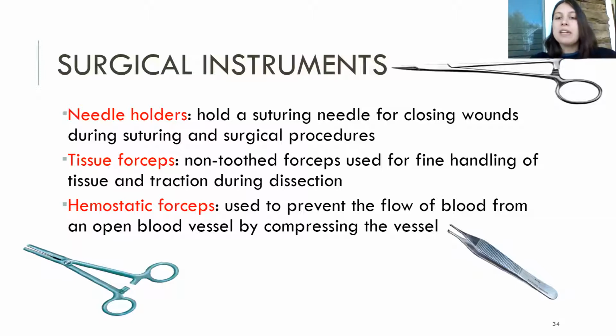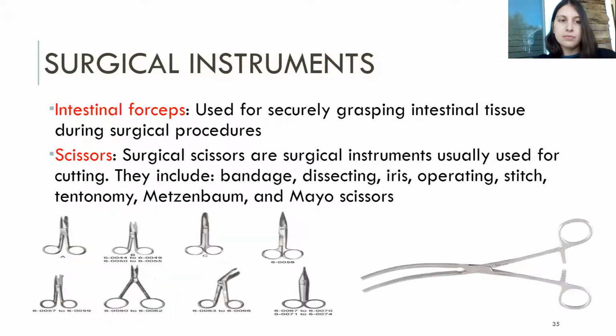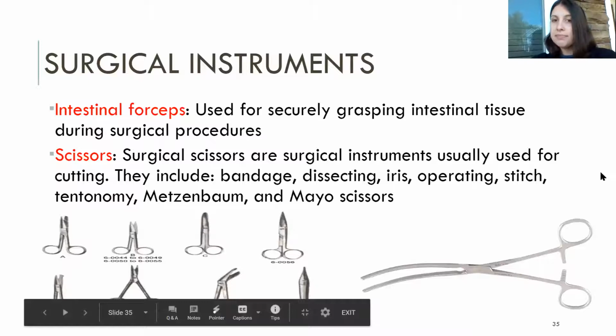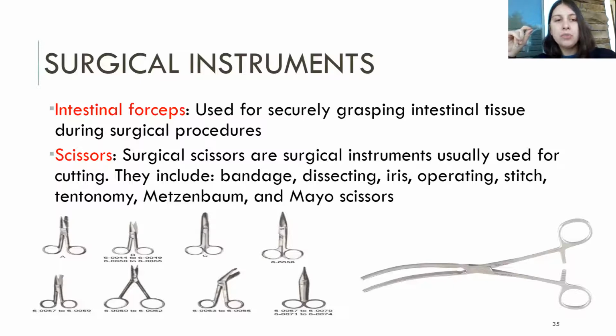Hemostatic forceps are used to prevent any kind of blood flow from an open blood vessel by, again, compressing and holding there and not loosening up. Intestinal forceps are used in the intestines, and they firmly grasp any kind of intestinal tissue during a surgical procedure. Hold it, move it, whatever is needed. There are tons of different kinds of intestinal forceps.